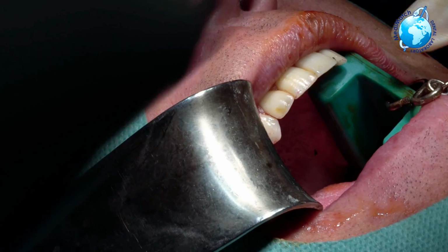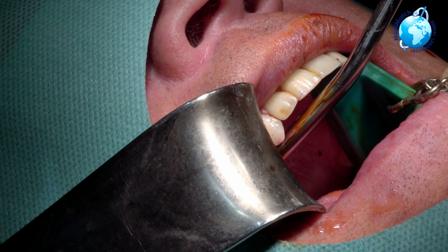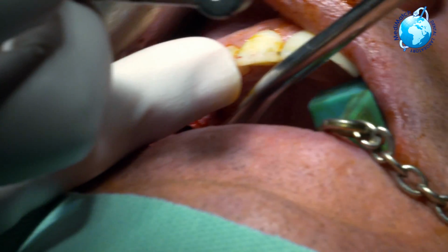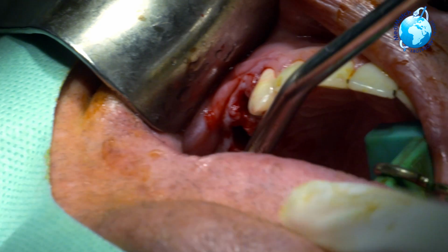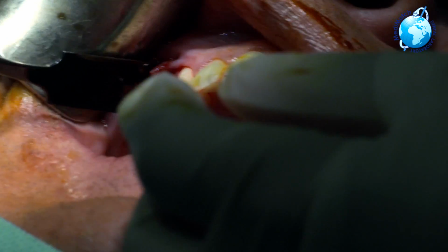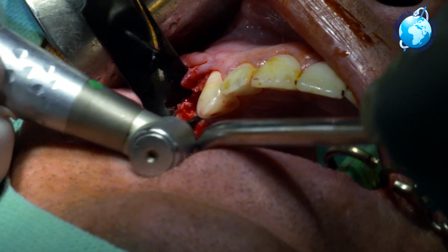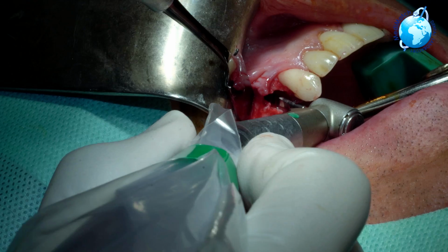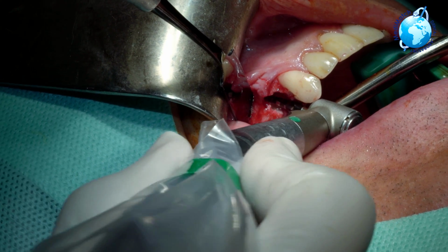Amazing. Alan, if you move that slightly that way, cheers, buddy. Right, you've got the drill extender. I'm just going to hold that there. You pull that. Got it? Okay, and we're just going to correct that to that angle there. See, we're knocking that tooth.